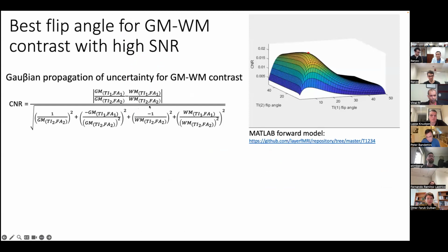With this model, we can optimize the gray and white matter contrast across protocol parameters. Specifically, we predict a combination of flip angles that gives us the best compromise of signal strengths, point spread functions, noise propagation, and B1 inhomogeneity, to ultimately make the data pushable through FreeSurfer.